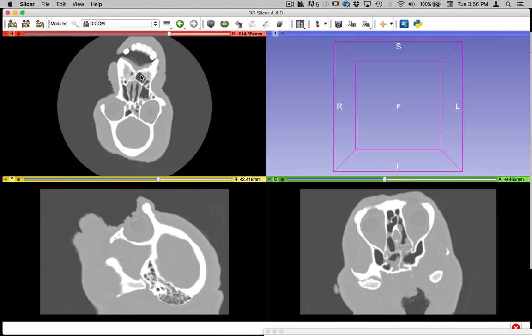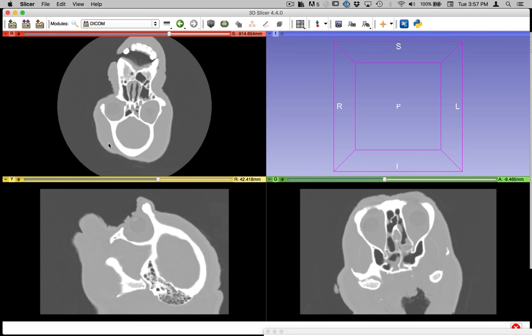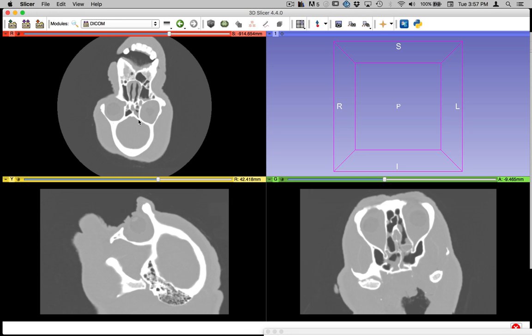So what you're seeing here are representations in color values, going from black to white, of different densities of tissue in the specimen. And in this case, the densest tissue is bone. And the densest tissue shows up as white. You can see the teeth here up in the red section and part of the brain case and the orbit here. And so we can use this differential density to extract different pieces of anatomy.